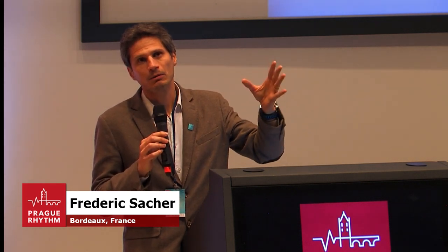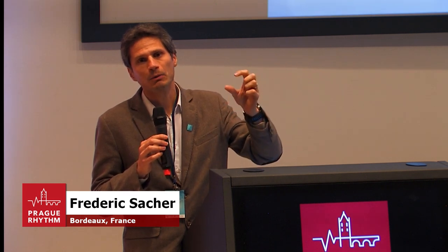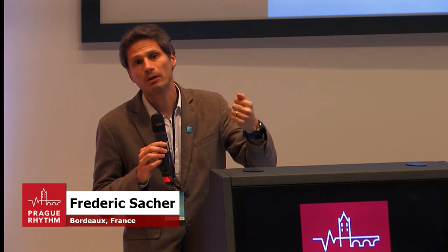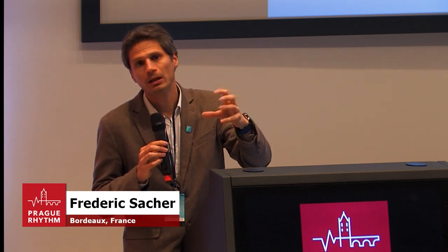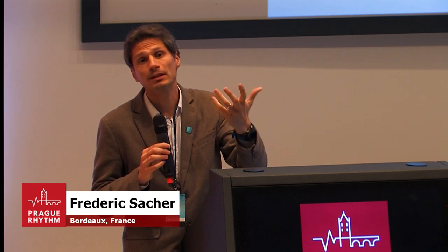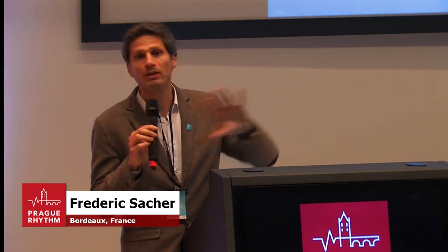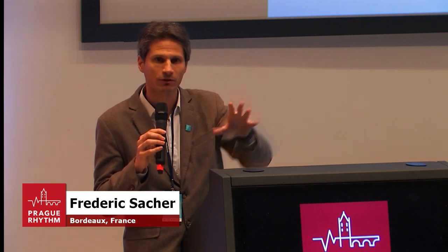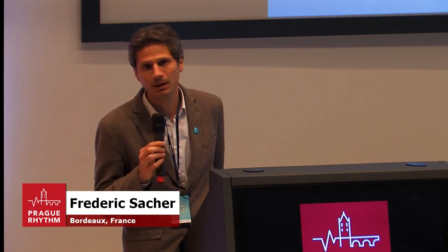During the pilot phase, we tried to position our lesion at different places of the isthmus, and at one point more at the entrance and exit in areas which were not so thin, and that was a problem. We had more recurrence. So it helped us to get this information not only on where the isthmuses potentially are, but also on where we should ablate, where it's the thinnest, because it's much easier to reach transmurality. And if I go back to your question on epicardial approach, for ischemic cardiomyopathy patients, nowadays we did quite a lot of this at first procedure, but not anymore. If there is epicardial substrate, it's different. But for those patients, we go mainly endocardial as the first procedure, and just in case of redo, we will go epi. But we can discuss more afterwards.